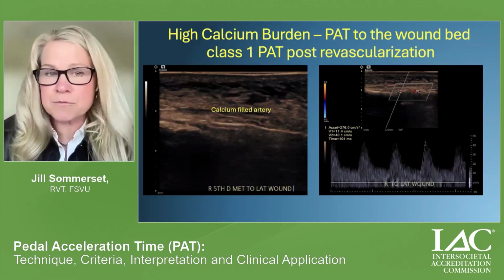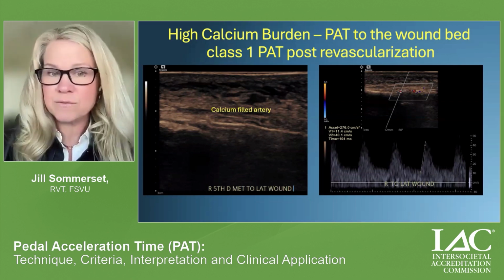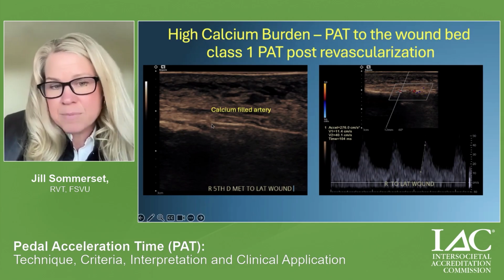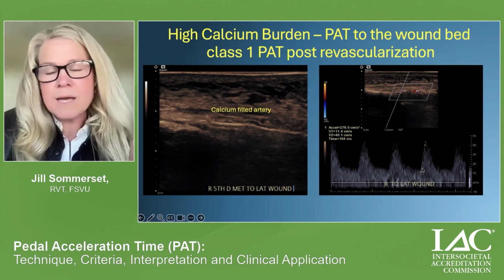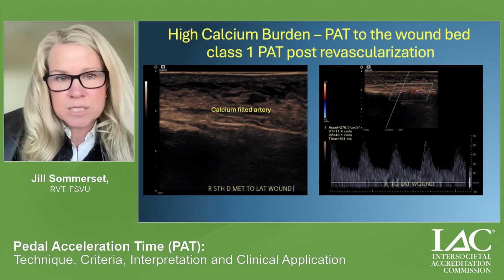When we translate that to the foot, you are going to see these calcium lined pedal vessels. And yes, they are tiny. Sometimes they can be 1 millimeter. But this is a metatarsal artery to a foot wound. You can see the calcium. Put a Doppler in there, and we have a measurable class 1 PAT post revascularization, and this patient did very well.